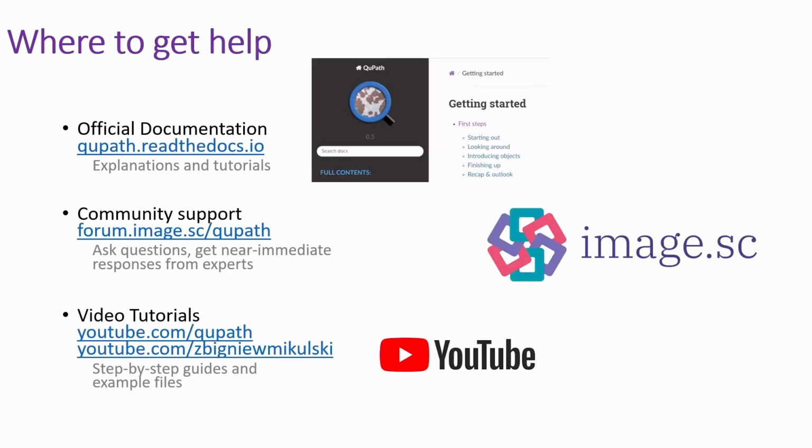Right, so if you are interested in QuPath, where to get help? I recommend the official documentation at qupath.readthedocs.io. This has a lot of explanations of concepts and some good tutorials on the most commonly used functions in QuPath. If you have questions, I really, really highly recommend the image.sc forum. You can ask anything you want. Beginner questions are great and get, honestly, near immediate feedback from experts around the world. I spend a lot of time there answering questions, and I ask a lot of questions there, and I learn a lot just by reading other people's answers to interesting questions.